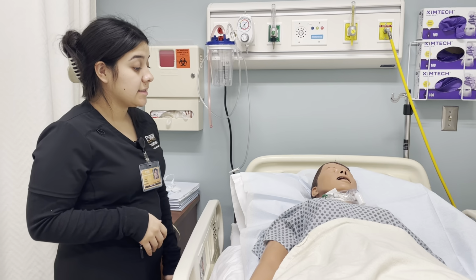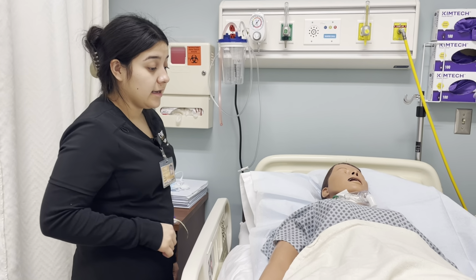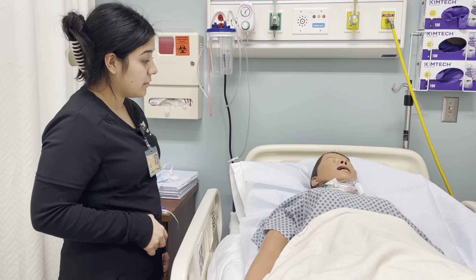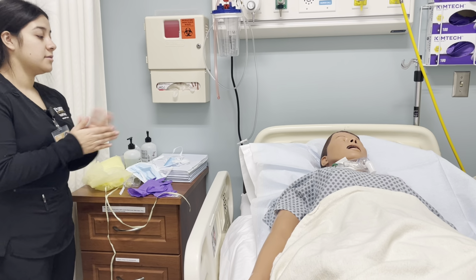I'm going to be your nurse today. I was looking over your health record and it shows that you're due for a dressing change. Is it okay if I do that for you? Yeah. Okay, I'm going to go ahead and start with some hand hygiene.